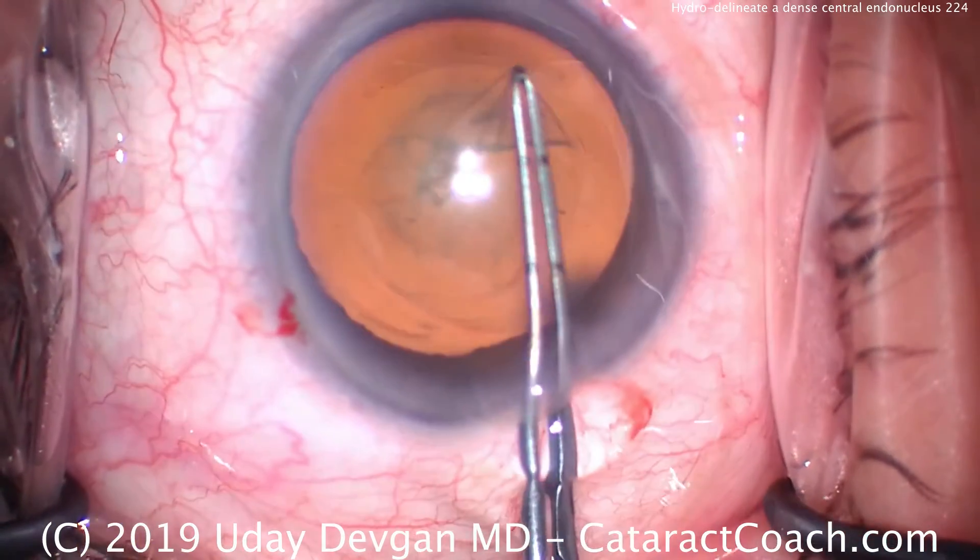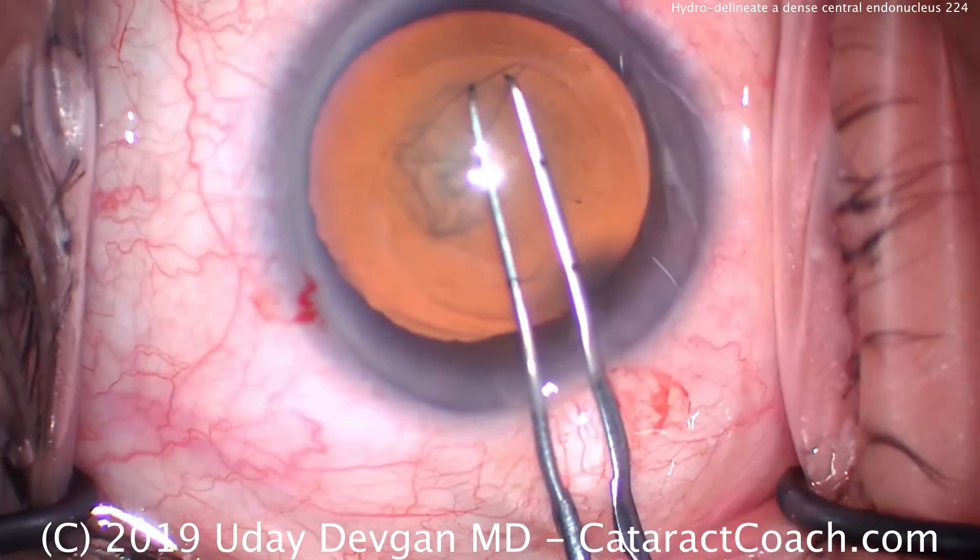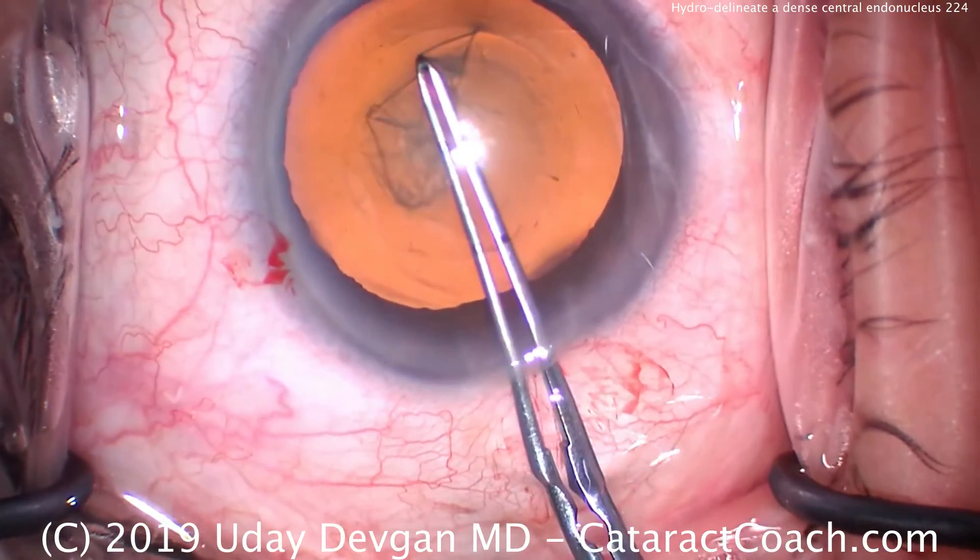We're completing our capsulorhexis, aiming for about a five or five and a half millimeter capsulorhexis so that it overlaps our optic. And that looks great.